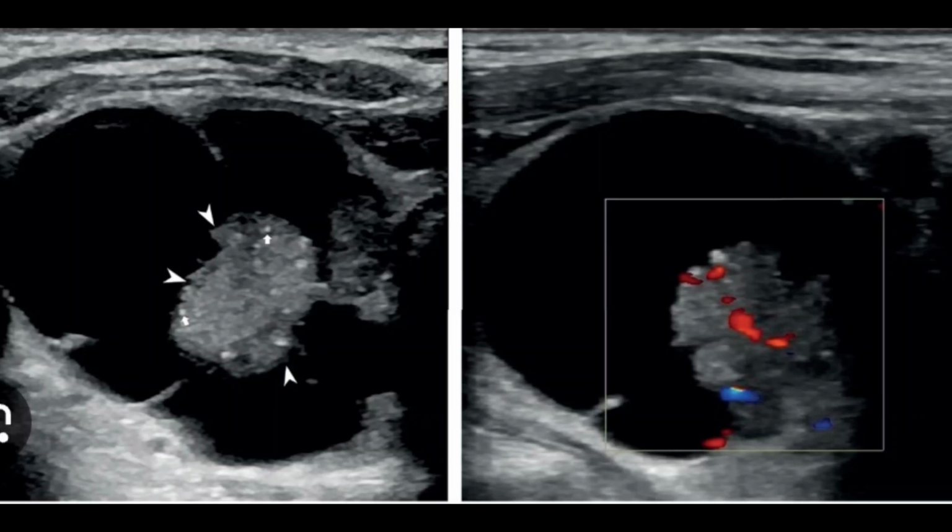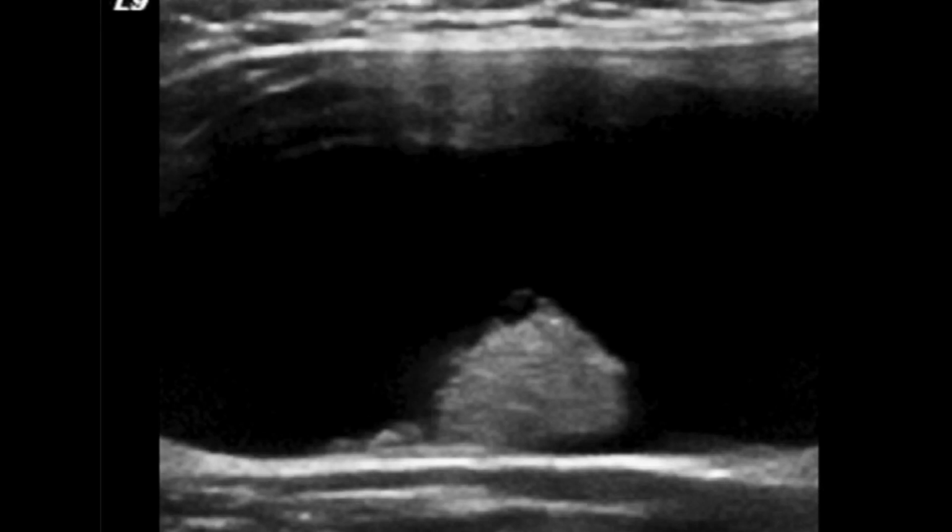So this is the thyroid nodule, and this is a cystic nodule. Within the cystic nodule, this is a soft tissue intramural nodularity. Look at the other side, you will appreciate that there is vascularity on the Doppler imaging. So within the nodule there is vascularity. So this is a confirmed malignant nodule, and it would be categorized as U5, and immediate workup would be necessary for that case.